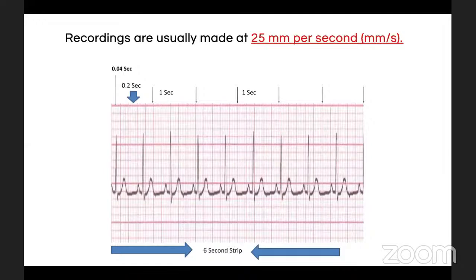طيب هذه زي نفس ما قلنا، قلنا أن هذا المربع الكبير represents كم 0.2 second صح؟ طيب كم أحتاج من بوكس كبير عشان يعطيني 1 second؟ 0.2 multiplied by 5 equals 1 second أوكي. يعني أحتاج 5 big boxes أو large boxes راح يعطيني 1 second. حلو. طيب عادة ال ECG strips تكون غالبا 6 seconds strip أو 10 second strip وإن شاء الله بنشوفها في الريت لما نجي نحسب الريت إن شاء الله.